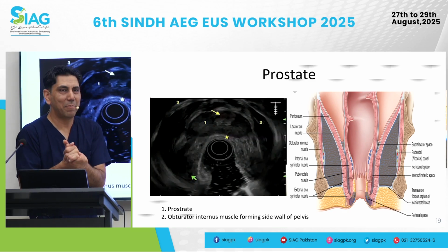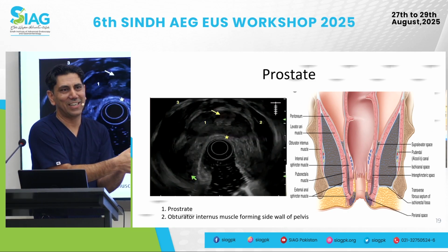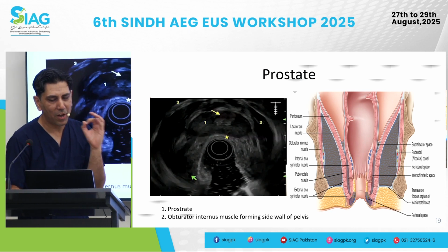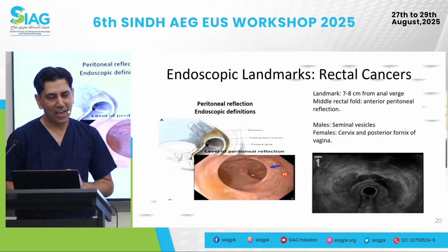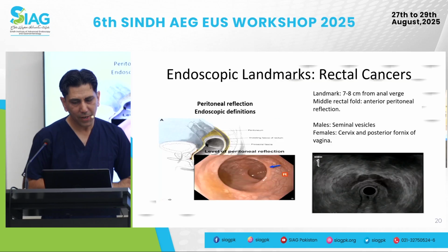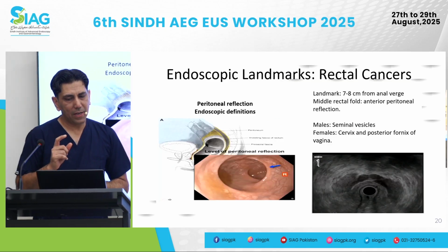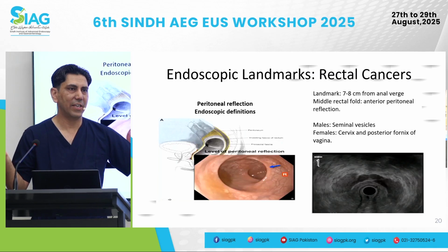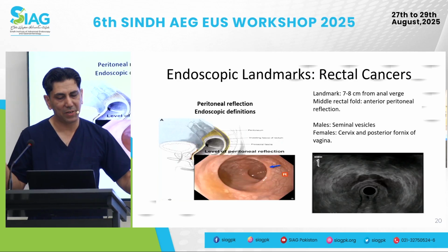I know this for a male patient, and I'm going to see the prostate in this situation anteriorly. Okay, so just reminding of what I'm doing, which patient it is, and how then I have to look at it. Now, the important thing, obviously, as I said, is the two modalities that we're briefly differentiating: inflammation versus a malignancy.